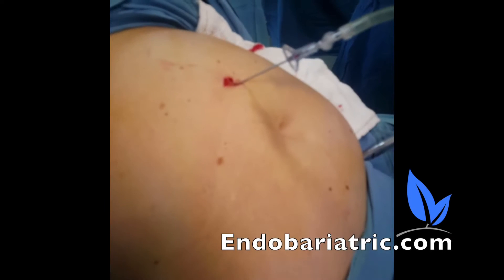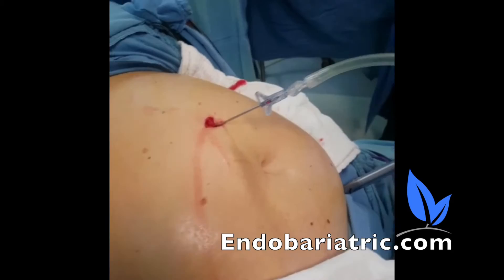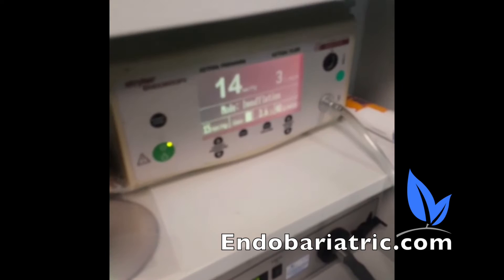We normally insufflate the abdomen with a Veress needle. This is a Veress needle — it goes into the abdomen and protects from puncturing intestines inside. The Veress needle is attached to CO2 gas, which goes to this machine right here, which is an insufflator that controls the inflow.